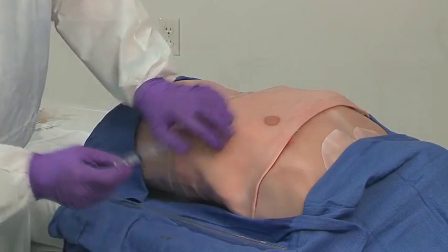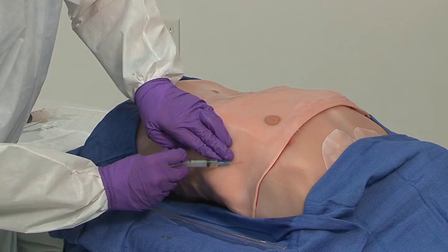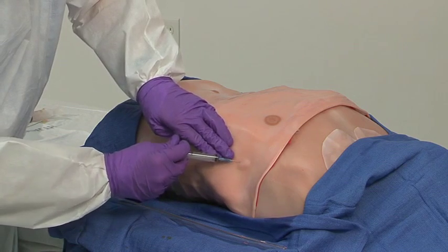If your patient is awake or conscious, it's a good idea to use some local anesthesia, as this can be a very painful procedure. Generally, we like to use some lidocaine with epinephrine, and we're going to infiltrate the skin over the area of the landmark, which is about the 4th or 5th intercostal space, just anterior to the mid-axillary line. I'm going to raise a little bit of a wheal.